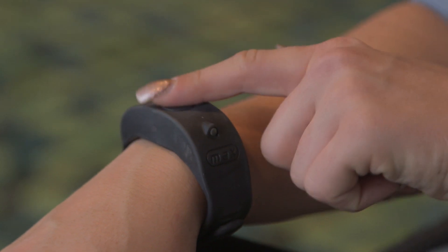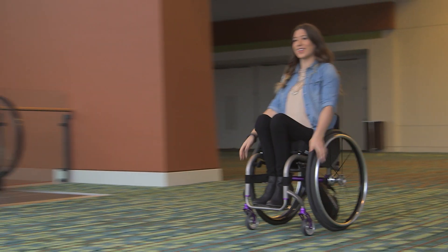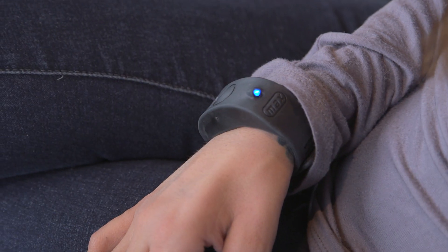To get going, just touch the button on the Bluetooth wristband, give it a push, and cruise. If you have limited hand function, you can use your wrist to turn it off and on.